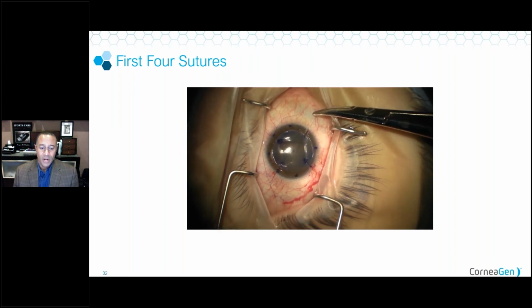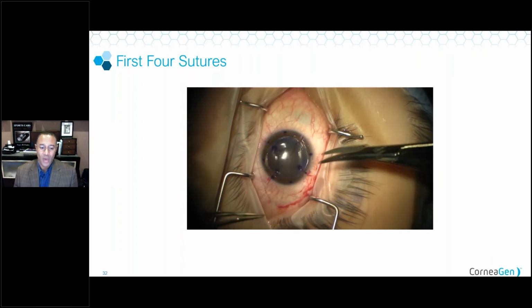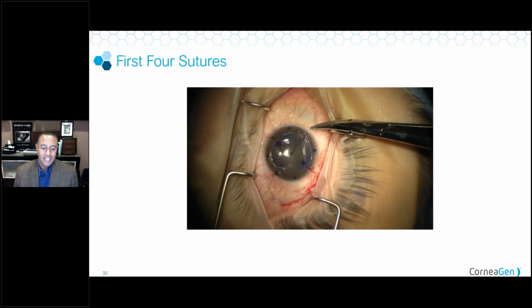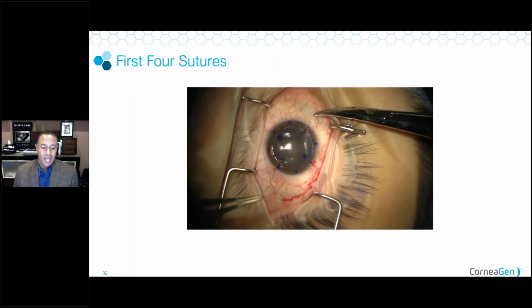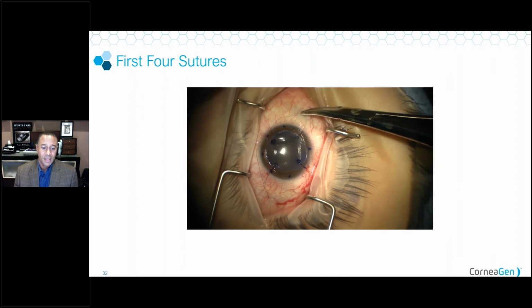Now, when I suture my corneas, I always suture dry, not wet, because I want to be able to see those stria in the anterior cornea. And seeing those stria in the anterior cornea helps control your astigmatism. So we go from a line when we have 2, to a triangle when we have 3, and then to a square when we have 4. Next slide.